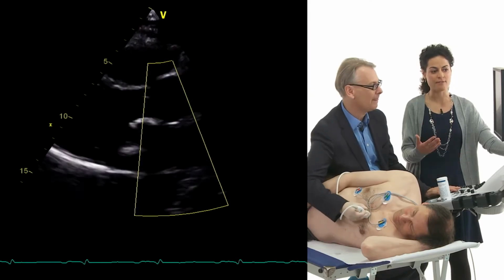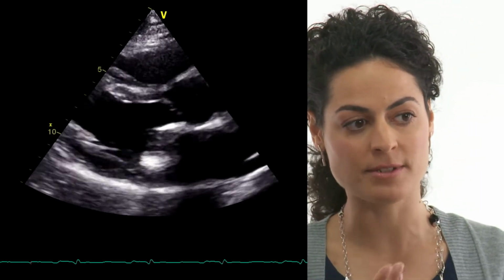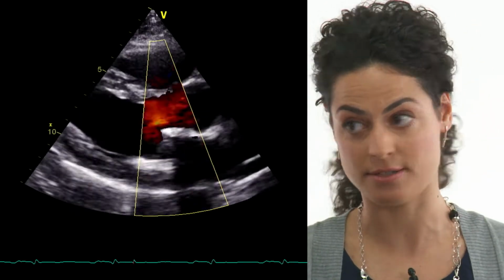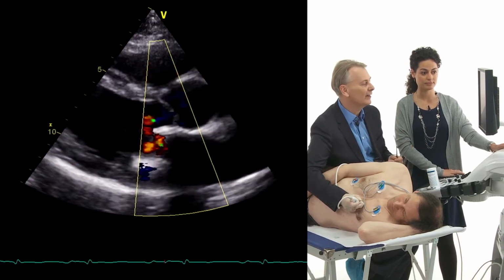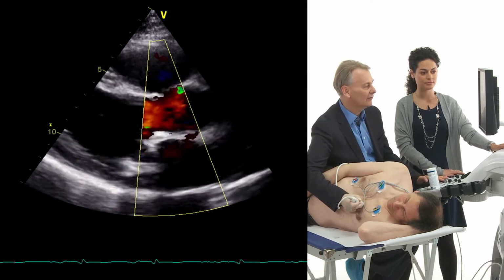Yes, because you have always to look for valvular regurgitation and paravalvular regurgitation. And Thomas is showing us that especially when you look for paravalvular jet, you can use the parasternal long axis view. Yes, it's my favorite view actually, because here we can look at portions of the mitral valve that are free of artifacts, especially the portion which is close to the aortic valve and the intervalvular fibrosa.